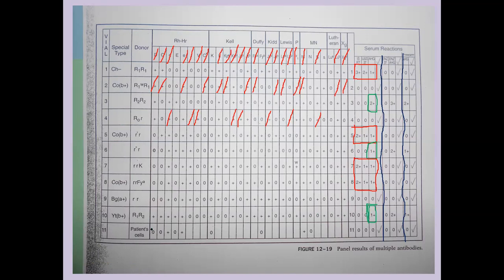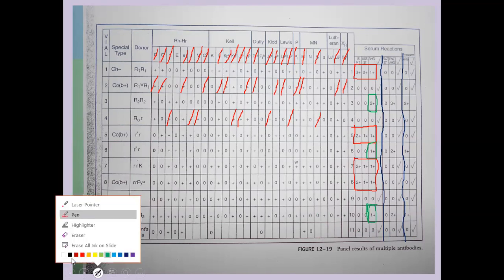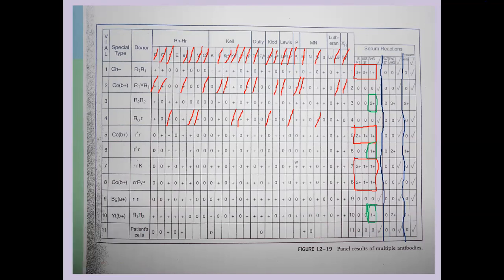Okay, and lastly, we have our patient control. Okay, and so patient, it's not an autoantibody nor a transfusion reaction to recently transfused cells. So this is what we have. So how do we move on? How do we move forward in light of all of this?